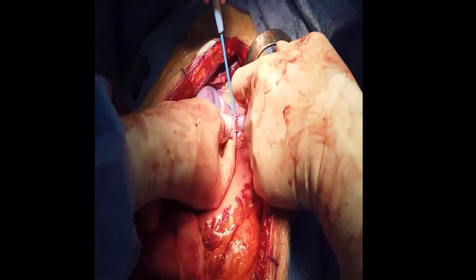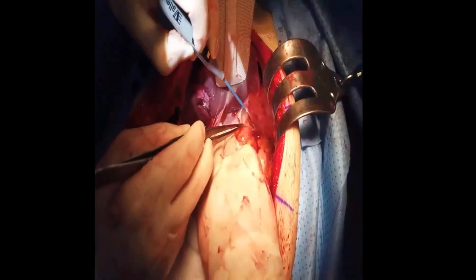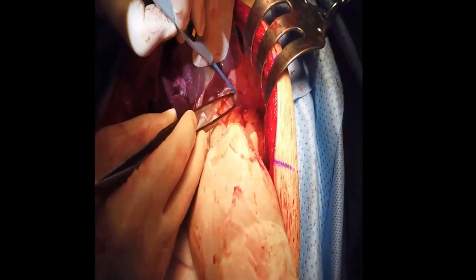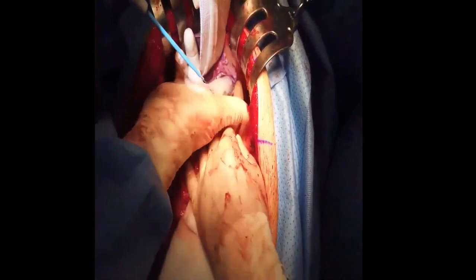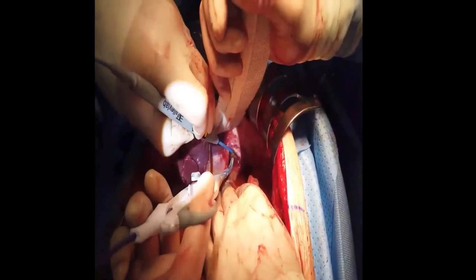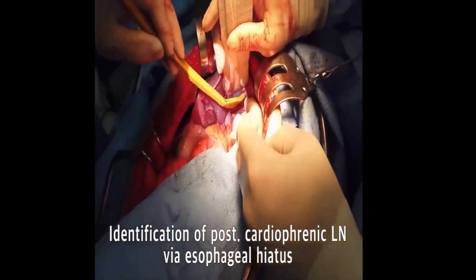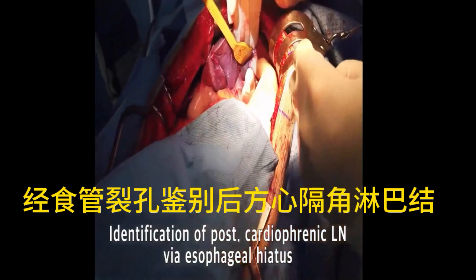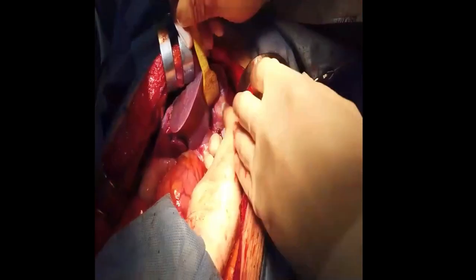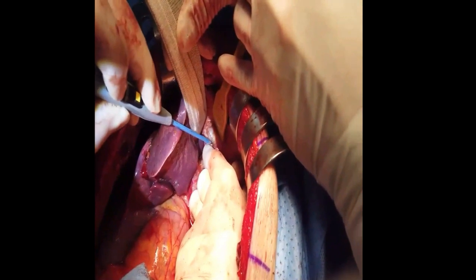Firstly, the triangular ligament is divided and retracted laterally to expose the esophageal hiatus. The esophageal hiatus is opened with a horizontal incision. After sufficient enlargement of the paraesophageal space, we can identify the posterior cardiophrenic lymph node via the esophageal hiatus using finger palpation. A small separate incision is made in the diaphragm where the lymph node was palpated.